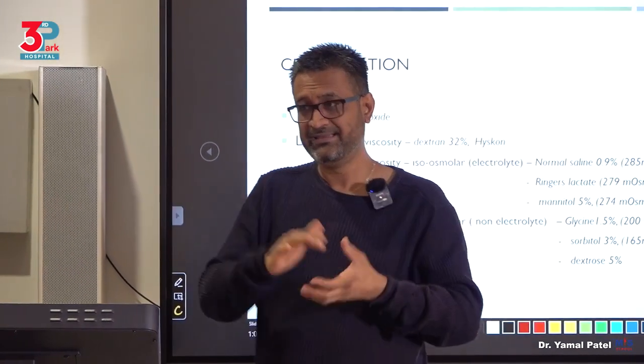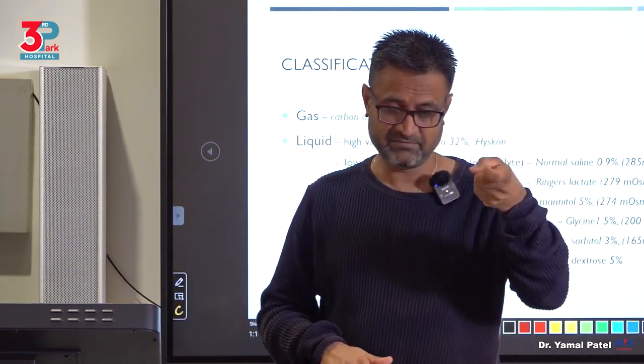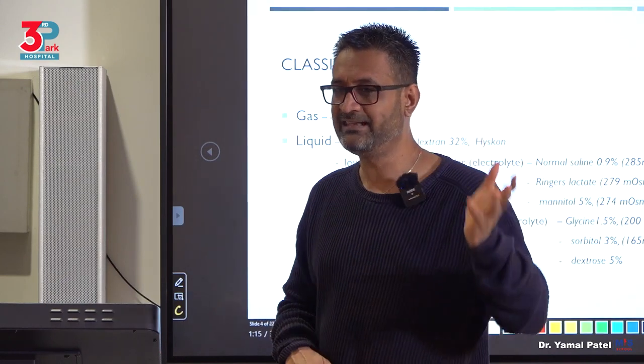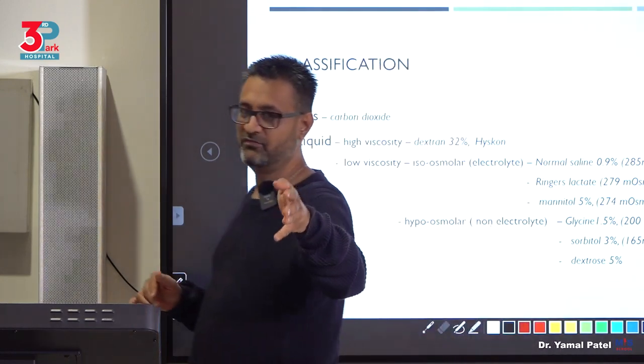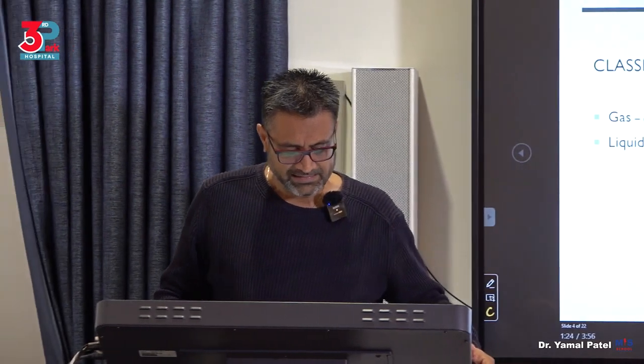So you can see it, but it's difficult to operate in because when you cut or something, the blood may not mix with it, but that liquid is not easily drained out. So it will remain there. You've understood the blood with all the tissue and everything. And the risks of hyperosmolar solutions might have to be kept in mind.